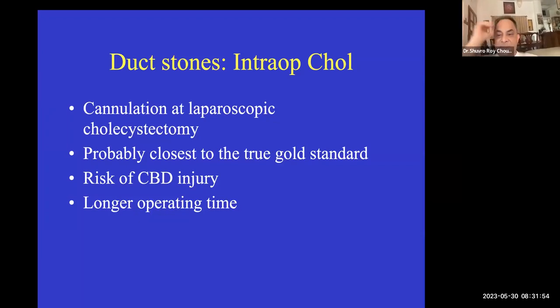So we did Spyglass and we did biopsies. We'll wait to see. There is some evidence to suggest that Spyglass improves the biopsy return rates. Of course, Spyglass is very, very good as a problem-solving tool for detecting any biliary anatomy that is difficult. There is absolutely no doubt.